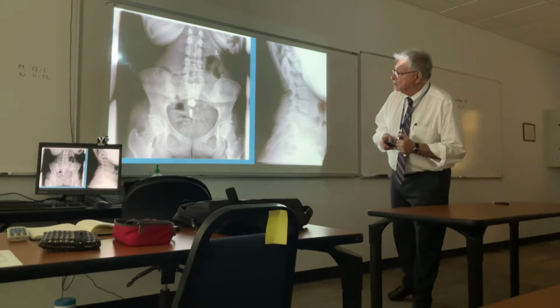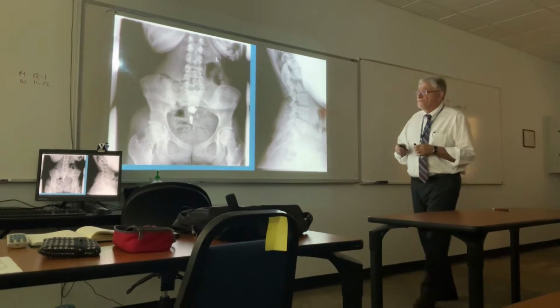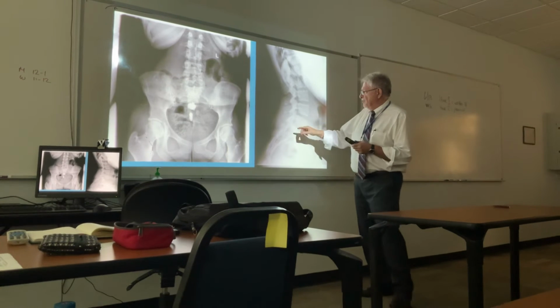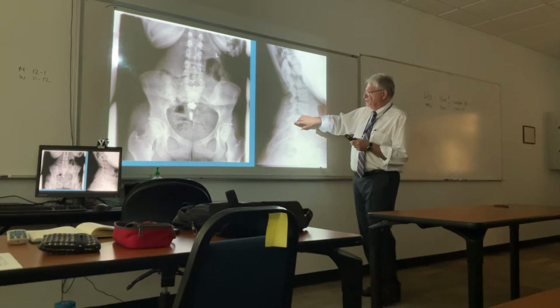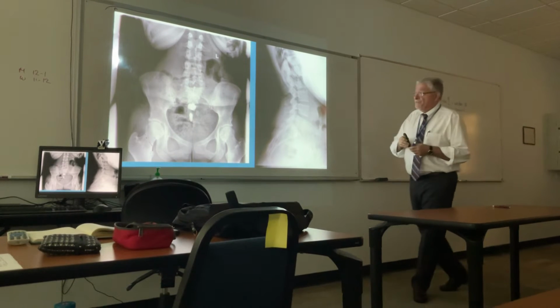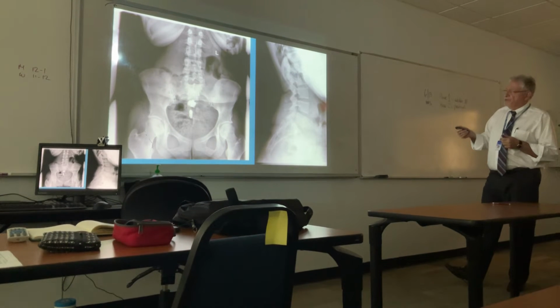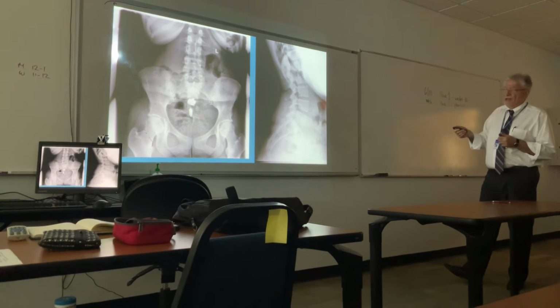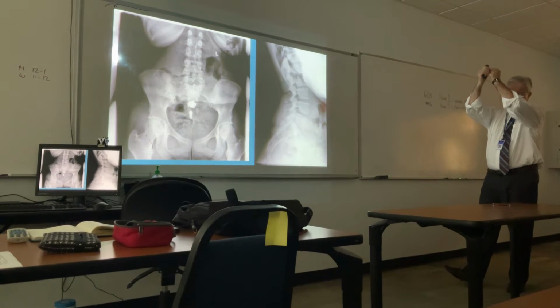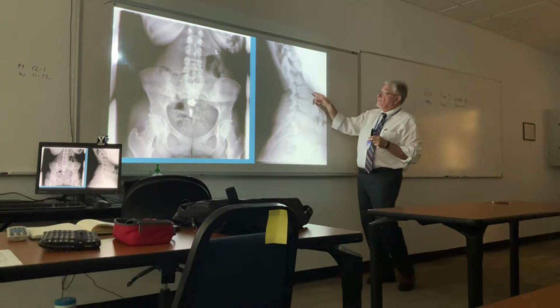Why does L5 look compressed? In what way? It looks like the vertebral body. Yeah, but you've got lordosis here, and if this is tipped a little bit within physiological range of motion, okay, it's doing this, okay? And the reason you can't see this as clearly is because of what you'd be doing on the lumbar spine exam lateral. Lift your hands up. Okay? So that's the same person?